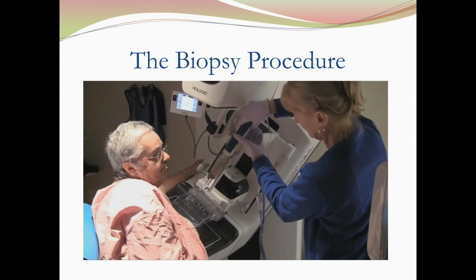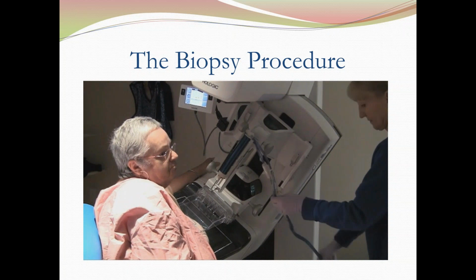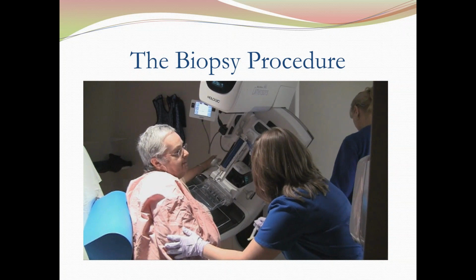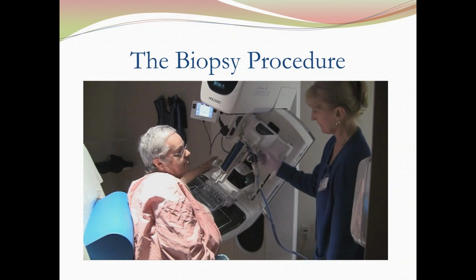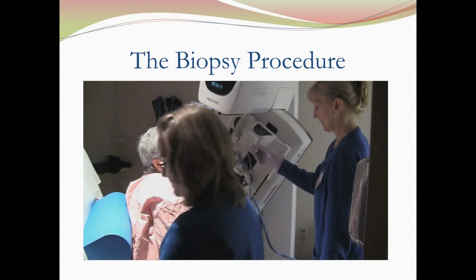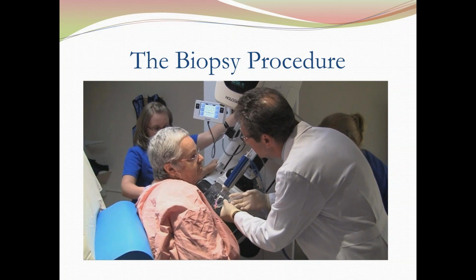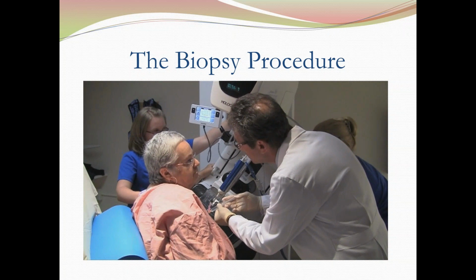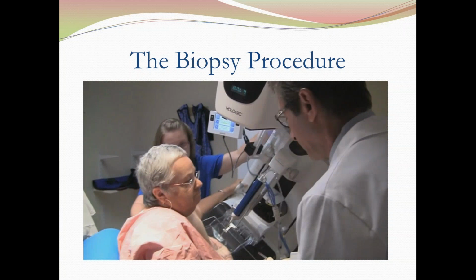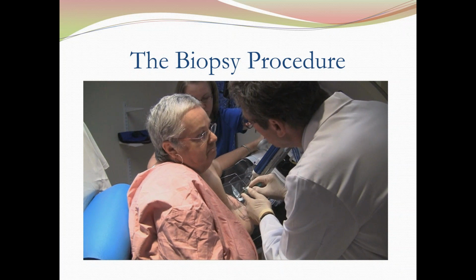Now here she is putting the device on. You can see it's pretty close to the face of the patient, but she's not really that bothered by it. We tell them to look away. Just not look at the device, and most patients are really great with this. You can see it's not particularly bothering her. The technologist is, she's now bringing the needle close to the skin, and I'm just putting in the local anesthetic now. And I make a puncture the same way that I do if I'm doing a prone case.